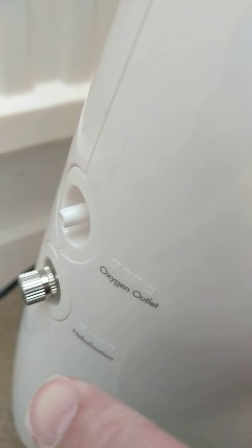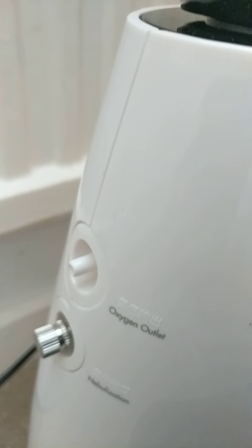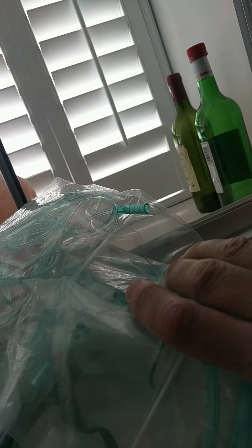This is where your masks get plugged in. That's the oxygen outlet and this is the nebulizer outlet. Here are your masks that come with it.